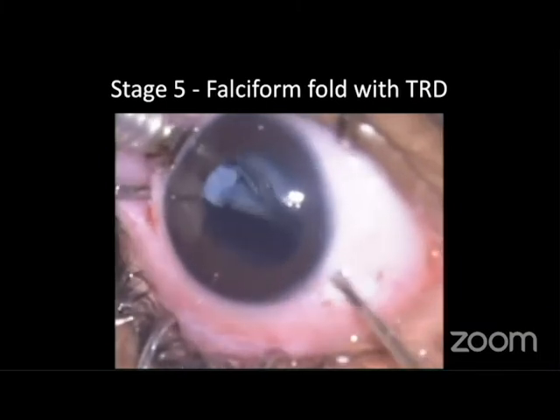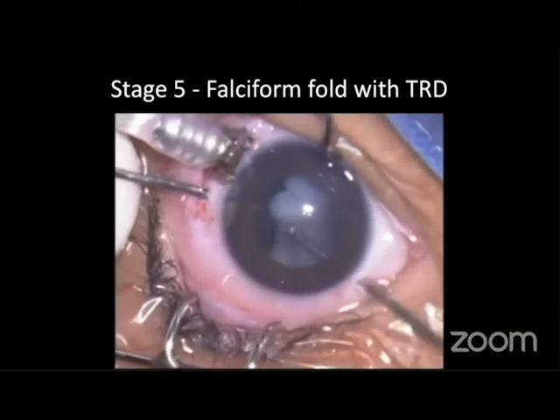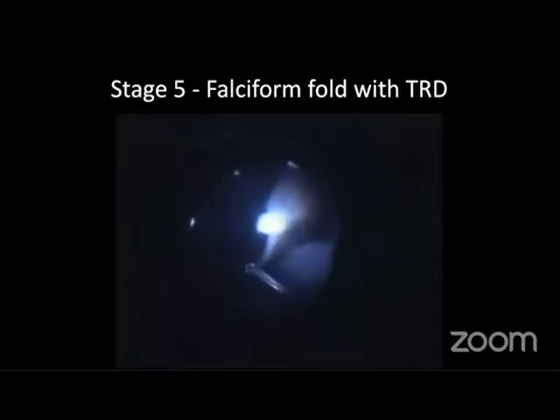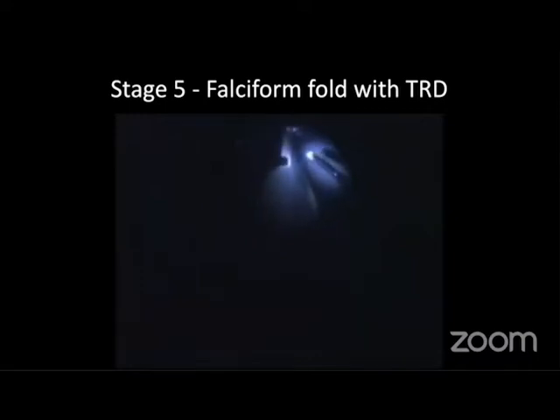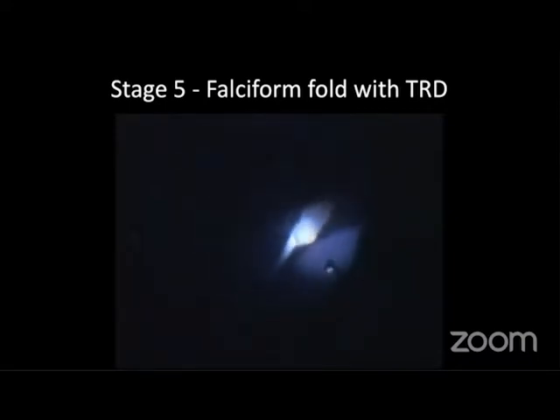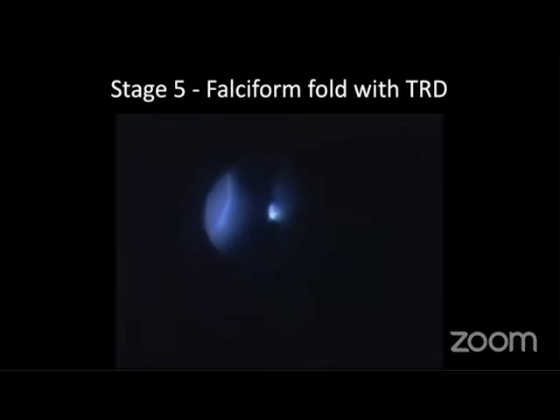As we all know, ROP detachment is essentially tractional most of the time. Very, very rarely it can be rhegmatogenous. So we relieve the traction and allow the retina to go back to its space. Some amount of vitrectomy around the falciform fold is done. Again, the vitreous may be attached in multiple places, very irregularly. So only the relevant traction is removed, as long as a PVD can be created safely.